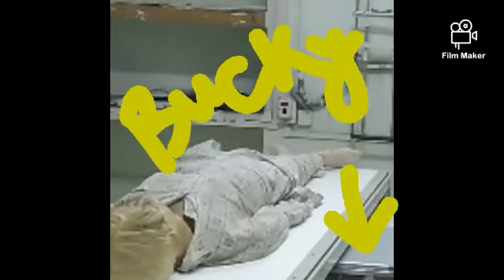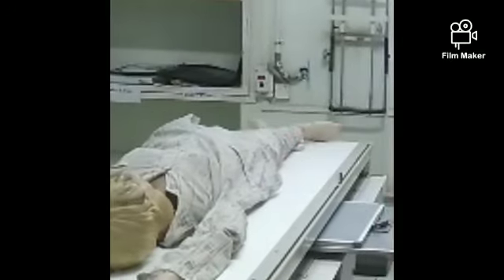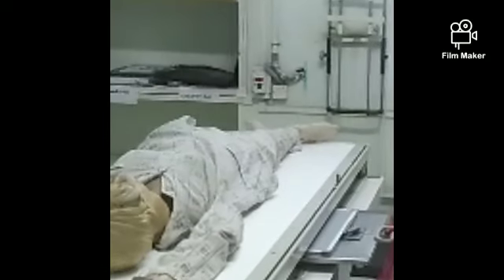You are not going to place the cassette below the patient, you are going to place it in the bucky. You are going to select the upper limit 2 inch above the iliac crest and the lower limit will be 1/3 of the femur. Next you can see here the area of interest is coming at your side, so you have to remove this from the field of view, that is called our FOV. You can keep the hands on the chest level or you can ask them to raise them over the head.